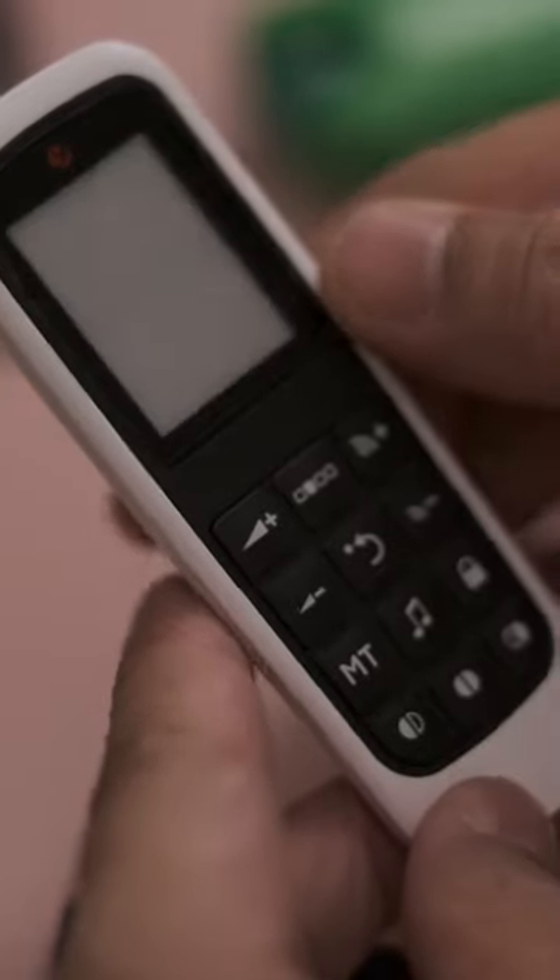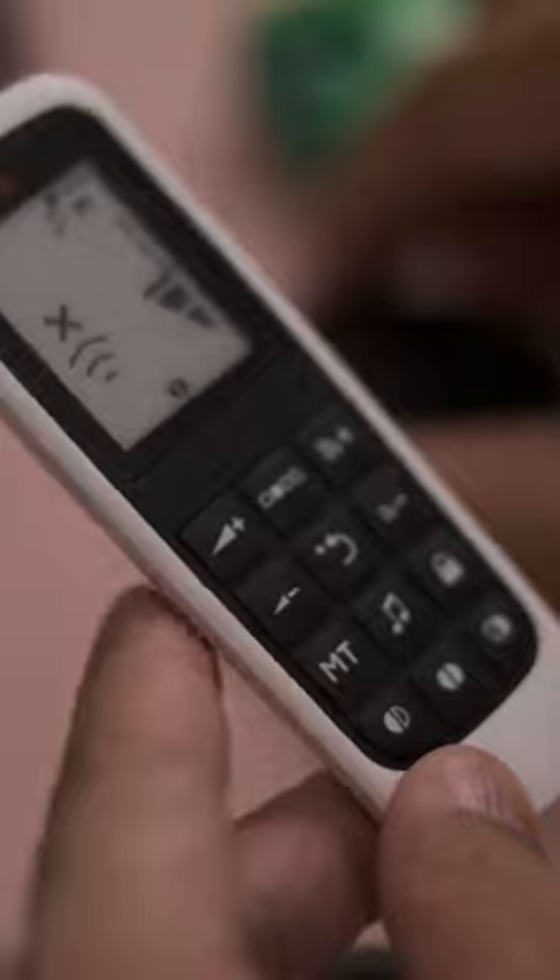To lock your remote control, press and hold the lock icon for about 5 seconds until the interface changes.